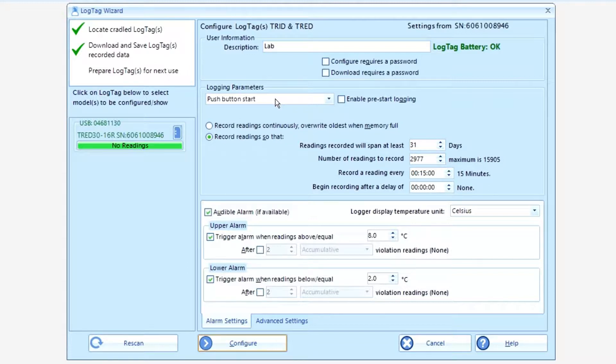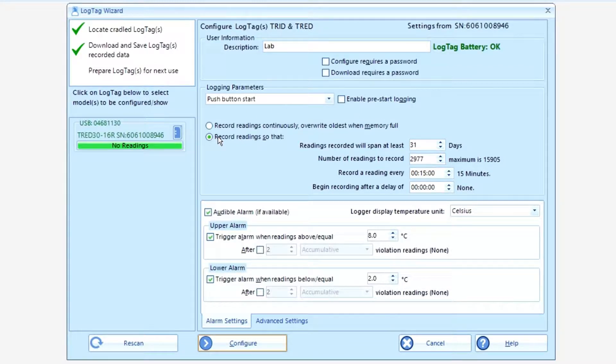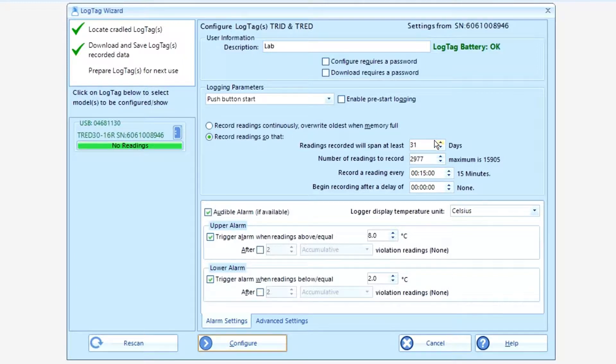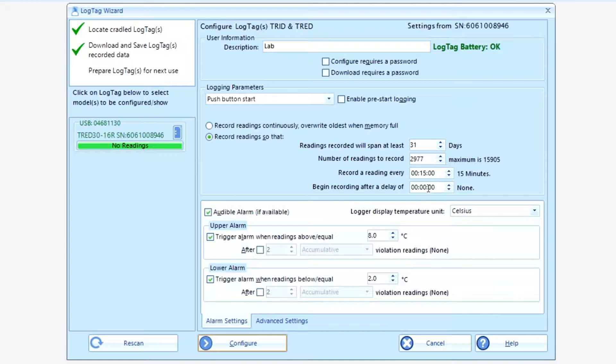We recommend push button start. Do not tick enable pre-start logging. We also recommend the choice record settings so that the readings are 31 days, number of readings to record 2977, 15 minutes, and no delay. These are all the default settings. Recommend just leave them the way they are.